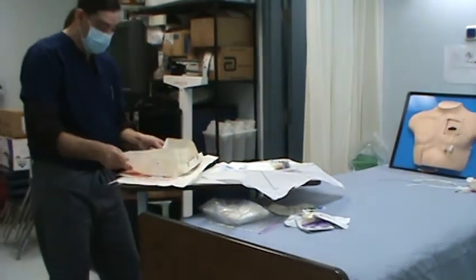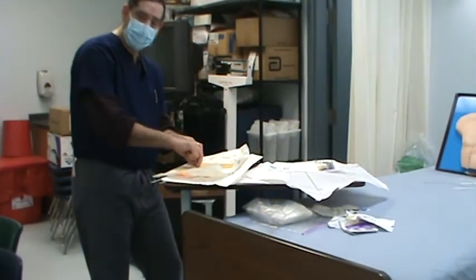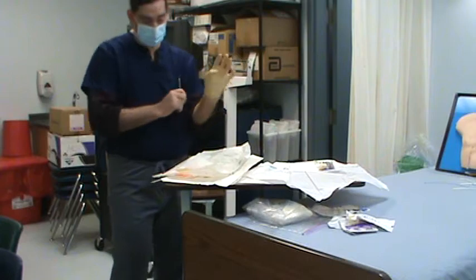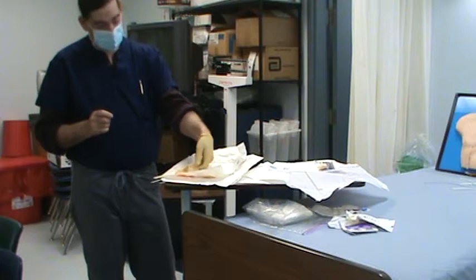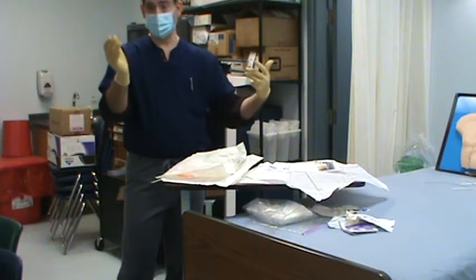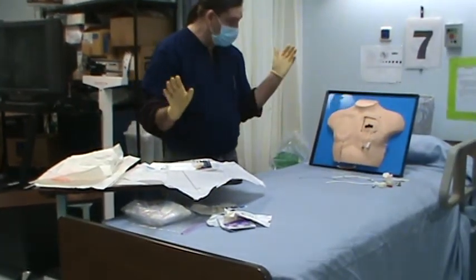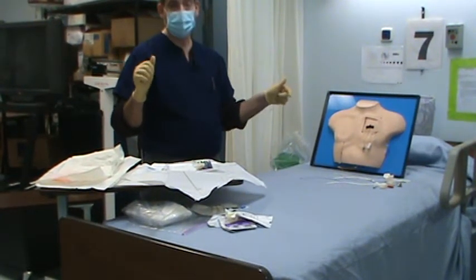So we put on our sterile gloves, and they have to be put on properly each time. Now in the sim lab, a lot of times I'll say, hey, you put them on right the first time, you just tell me you're putting them on, and that's good enough for me. But for students, the more times you see gloves put on properly, the better off you are. And you get to where you can do this practically in your sleep. But I have put on sterile gloves and not remembered how I put them on because it's 4 in the morning and I was actually halfway asleep. I'll put on new gloves because I want to ensure that I put them on properly. So now I have sterile gloves on, I have my patient with the dressing off, I'm ready to go.